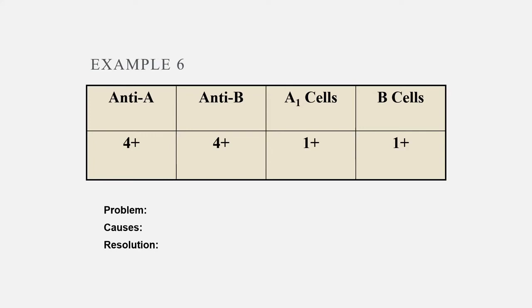That's something that was done at OneBlood or something. At LifeSouth, yes, or OneBlood. Yes, that's what they do. They send off to a reference lab, which reference labs are normally at blood centers. Yes, although they don't have to. This is something that a hospital could do on their own. It's really about who you have and if they know what they're doing.